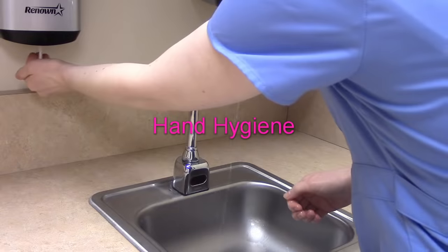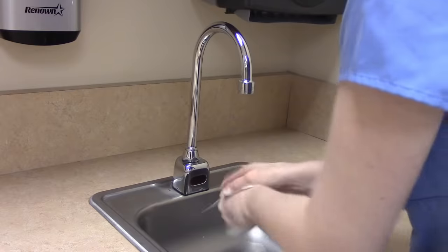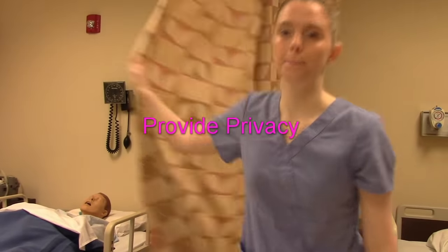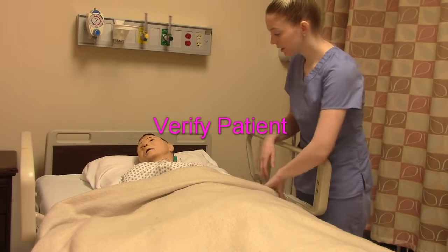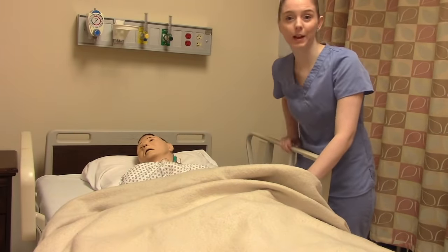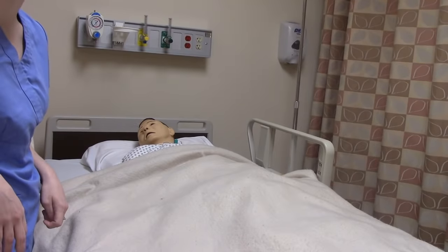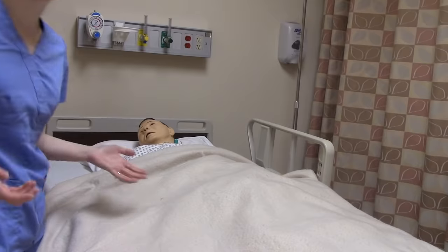Wash our hands. Provide patient privacy. Verify our patient using two identifiers — can you please state your name and date of birth for me? It matches what's on their wristband, so this is the right patient. Explain to the patient that you're going to be inserting a Foley catheter today. Get the bed up to a working height so you're not bending over and hurting your back.